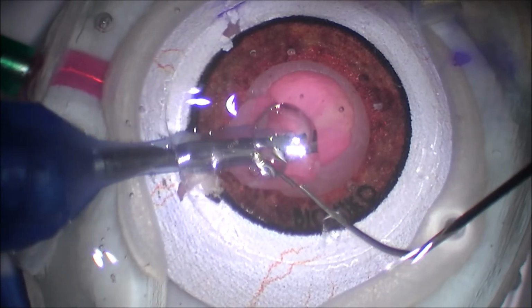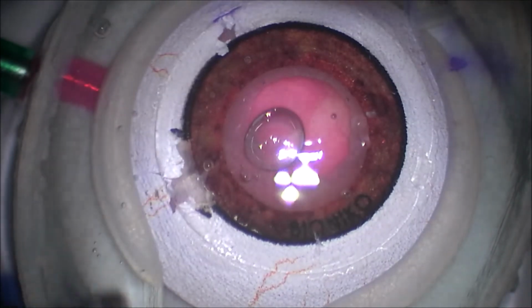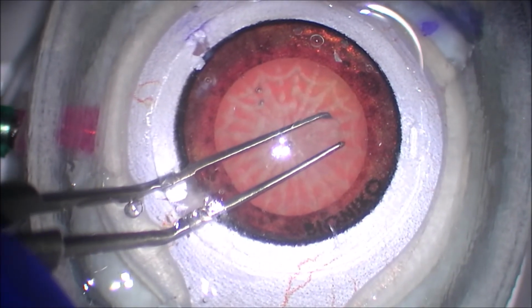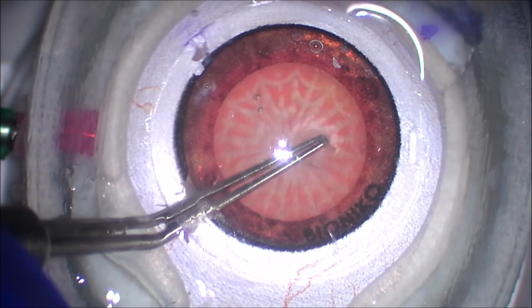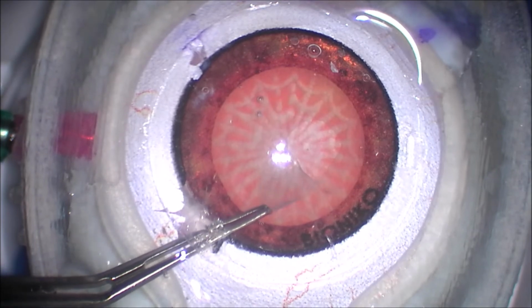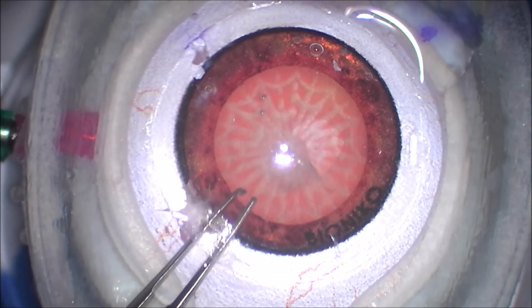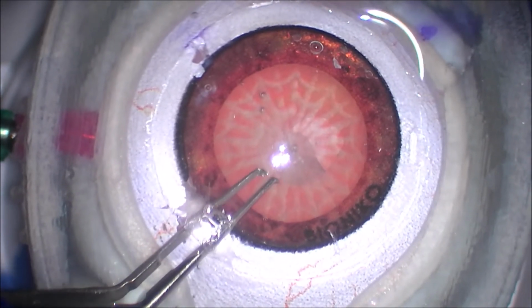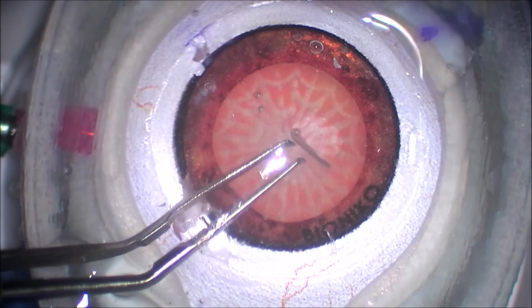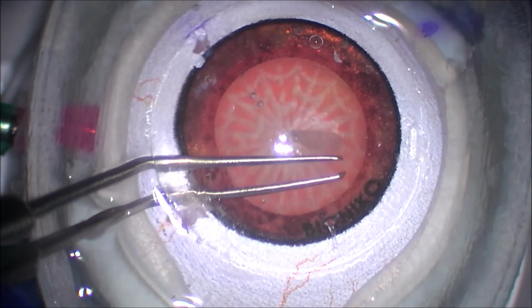And so that's it. That's the end of the case. She's removed all the lens. She's got a nice continuous curvilinear capsulorhexis. And again, I do feel like this is excellent maneuver simulation versus a tissue simulation. It does teach how to place your incisions, how to manipulate your instruments within the incision without overlocking yourself, without moving the eye too forcefully, and then performing capsulorhexis, and again, performing phaco, understanding how deep to groove, where to groove, and then you're leveraging the phaco machine and using aspiration vacuum, grabbing purchase to grab the lens pieces up out of the bag. So I feel like this was a very good exercise.